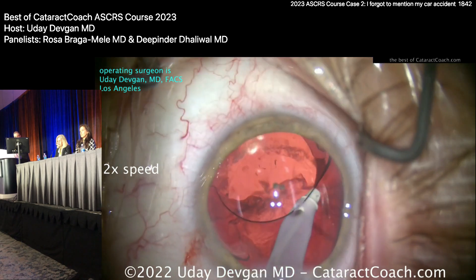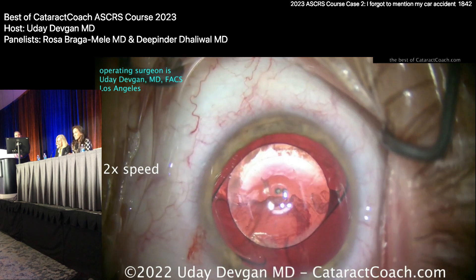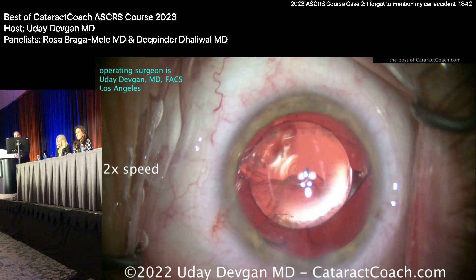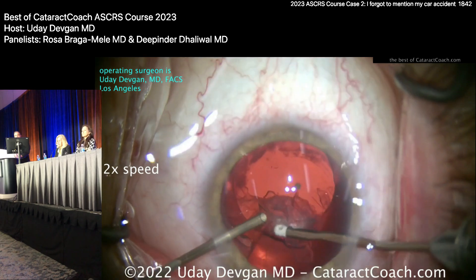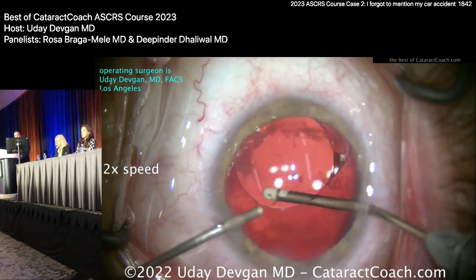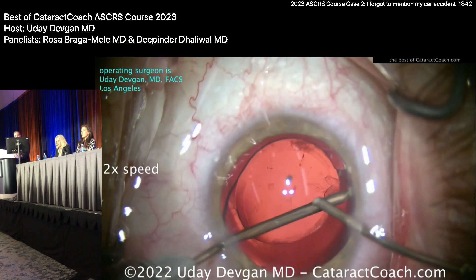Trying to get it with the coaxial I/A — going under the lens to get that remaining cortex. It looks pretty good. Now doing bimanual I/A through an extra incision — I decided not to leave that material in there to YAG later. The YAG spots aren't even the main concern; it's the inflammation. Bimanual I/A is a huge help here — you can really clean things up nicely. Switching hands and getting over there, last bit of it, looks pretty clean.